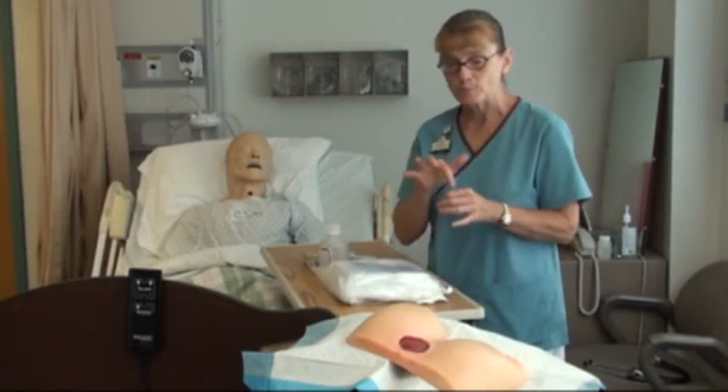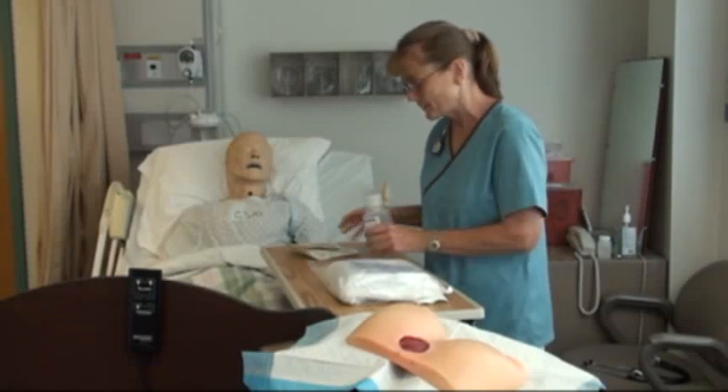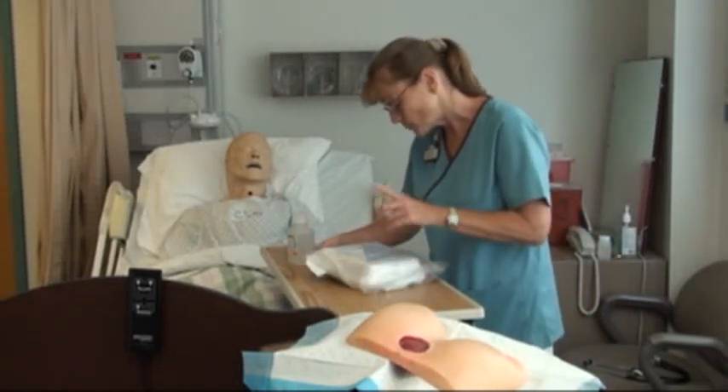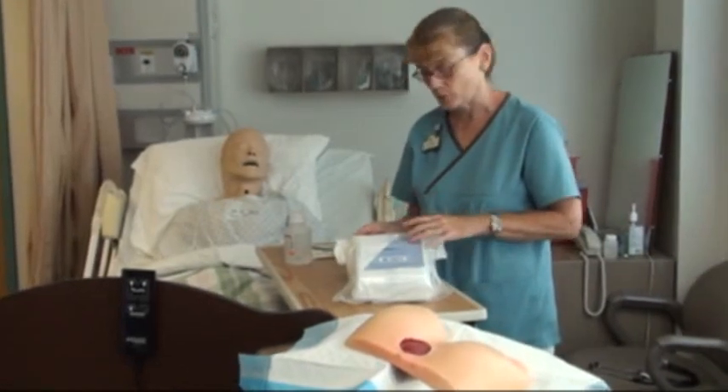Make sure you know the allergies because we're going to be packing directly into the wound. In this case, our order was saline, so we'll be pretty safe with that. The table looks clean and dry, it's at my waist level. My pack looks fine, the expiration date is good, and it'll tell you exactly what you have in here if you don't know.